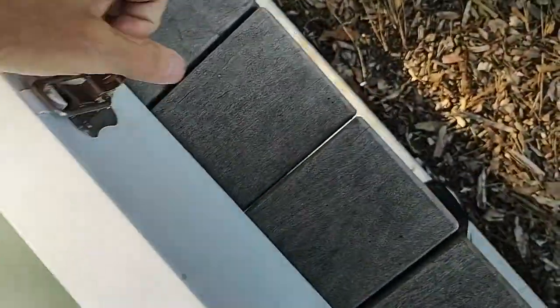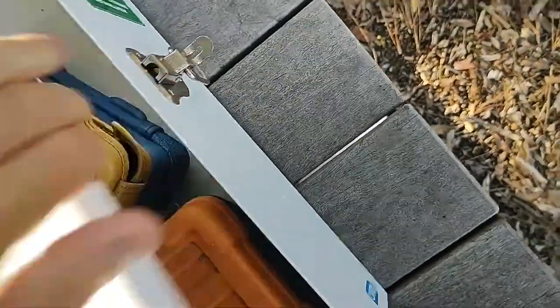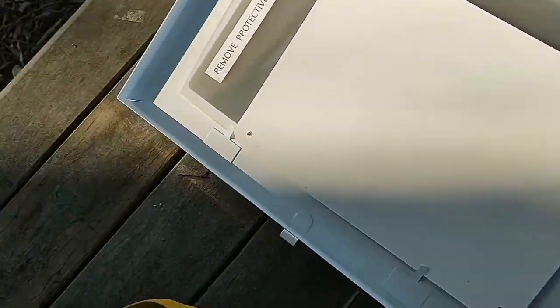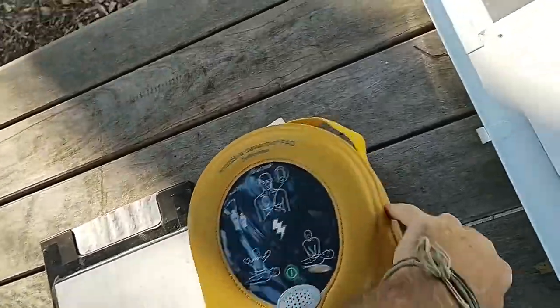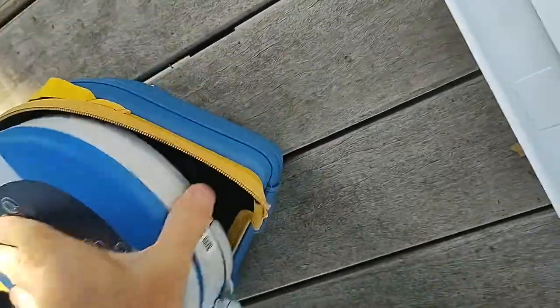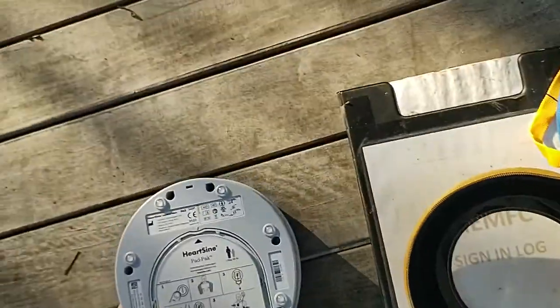Pull this thing out, put it on the table, open it up, pull out this part. You've got to unzip it — I'm doing this one-handed — and there it is.